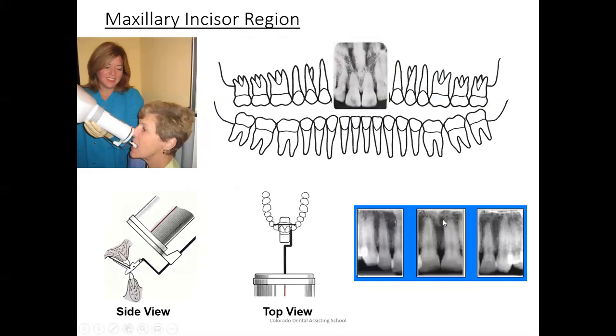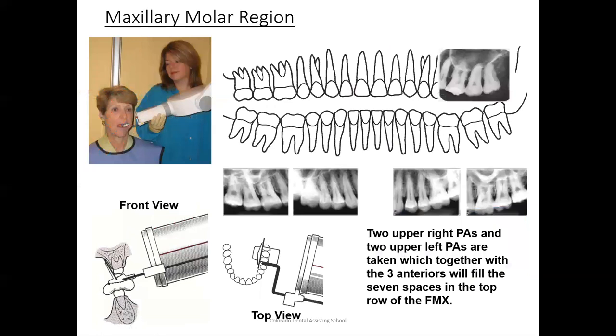In reality, it should be dead on like this, where we're looking straight onto the tooth and the roots don't look short to us. If you're too far below the root and you're pointing up, it could elongate it and kind of stretch it out and make it look funny. So you want to be careful with the angle. Try to keep that bar as straight as can be with the x-ray head, and you're in good hands.